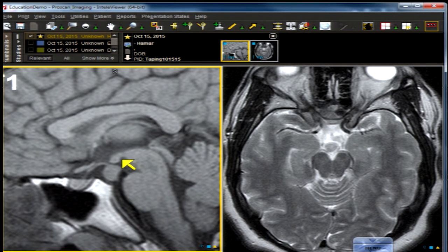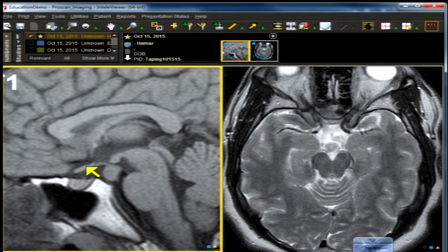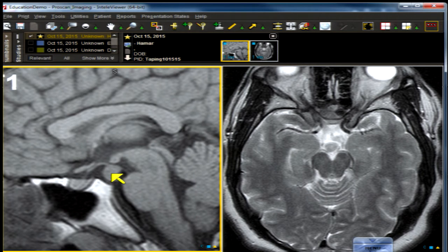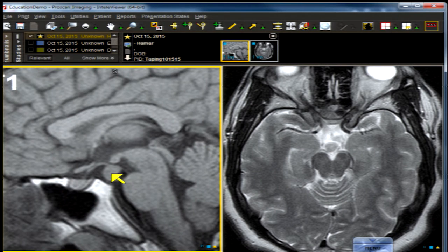This hamartoma has a different locale — namely the tuber cinereum — with that tongue-like protrusion beneath and sometimes behind the mammillary body. Unlike a chiasmatic glioma, it does not involve the optic chiasm. You may hear the term 'hypothalamic chiasmatic glioma' when both are involved. Craniopharyngioma is not a good choice — these are not smooth, gray, homogeneous lesions; craniopharyngiomas calcify and are not associated with episodes of lost attention.